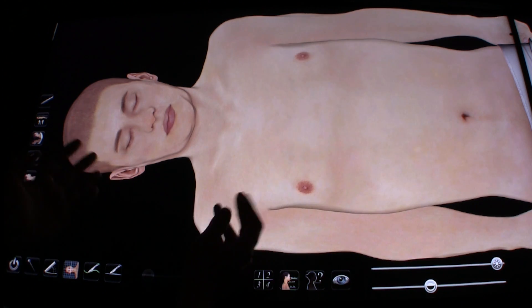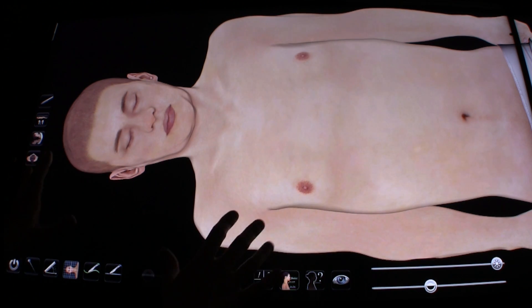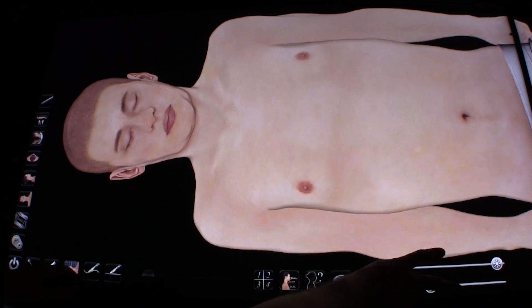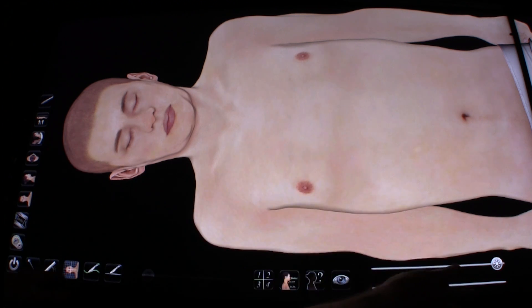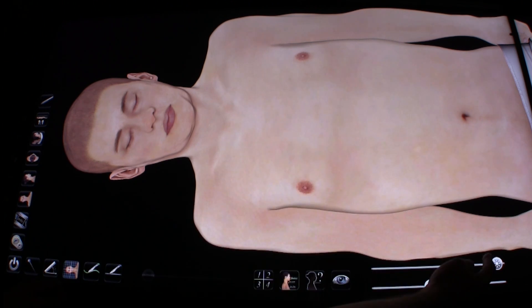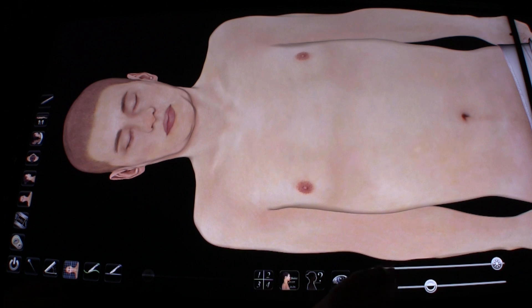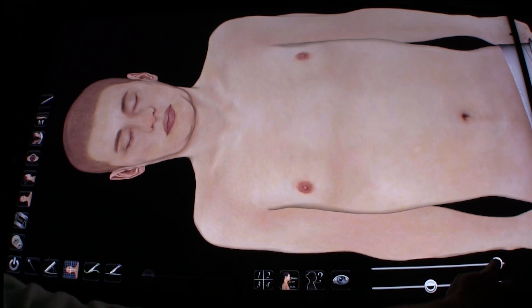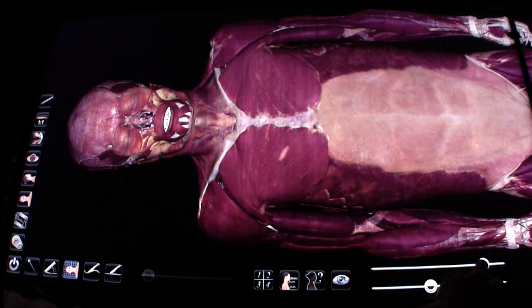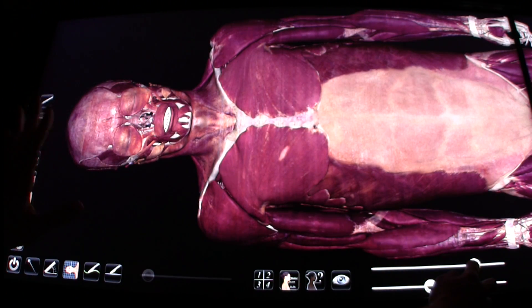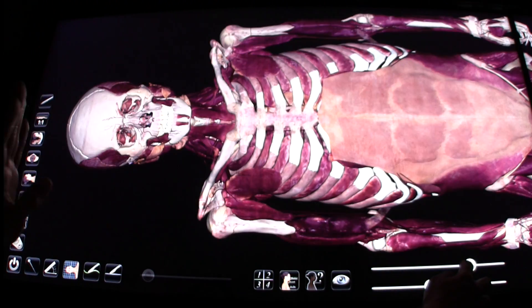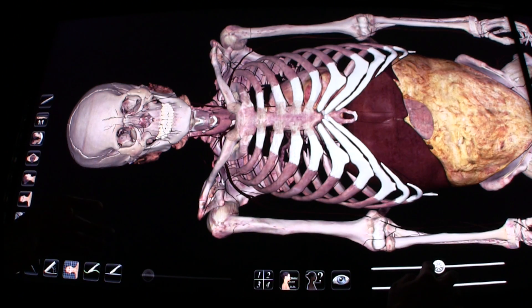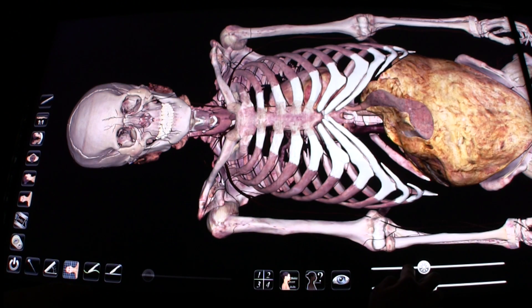Now the Anatomage Table has many unique features — we're only going to cover a couple of them in this introductory video — but two of them are these sliders on the bottom right-hand side. We have the brightness slider and the contrast slider. How these work with three-dimensional models is if I slide the brightness slider to the left, you'll see it goes through some predefined views and slowly removes layers of skin and other tissue and organs, eventually down to the skeletal system.